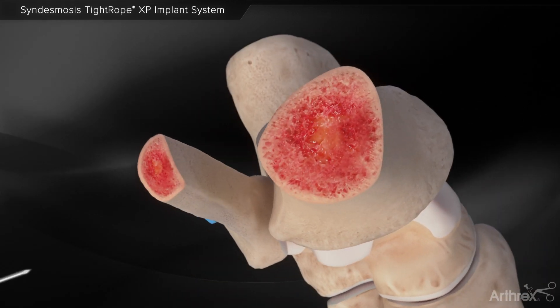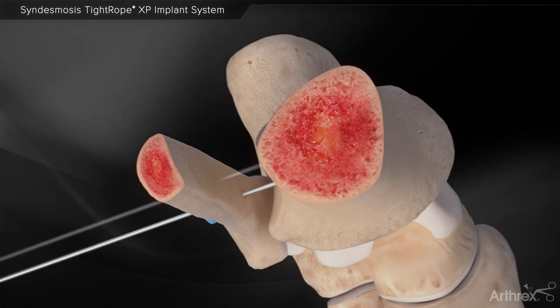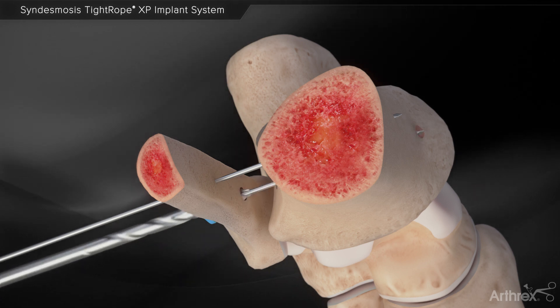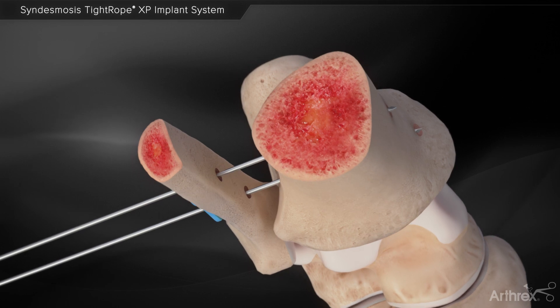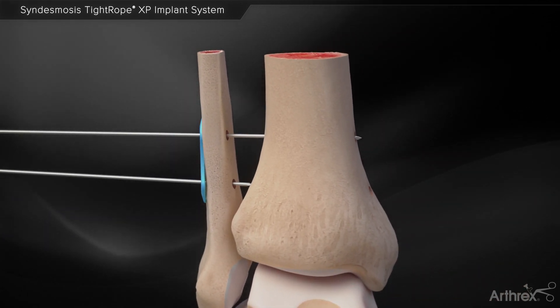Insert the K wire through the distal hole aiming 30 degrees anterior on the medial tibia. A second K wire is inserted in a diverging fashion, and a 3.7 mm cannulated drill is used. The inferior K wire is then removed.